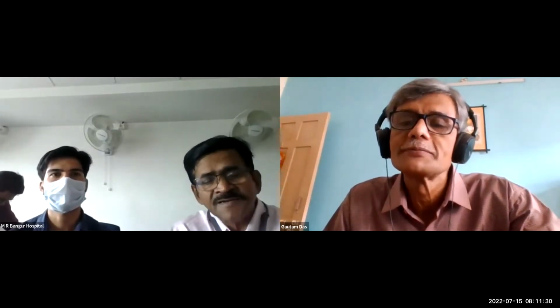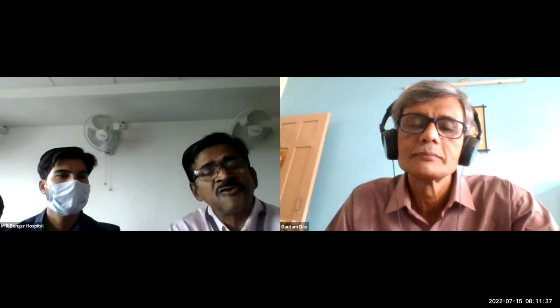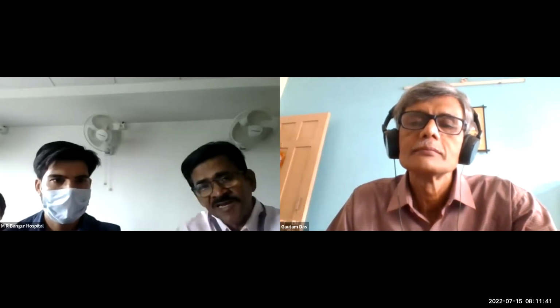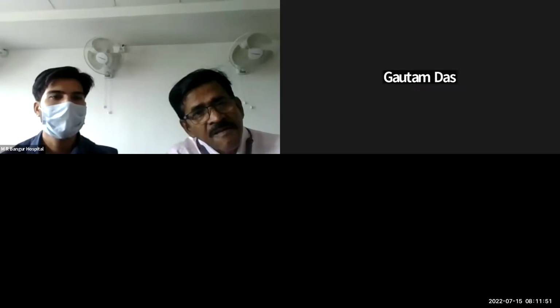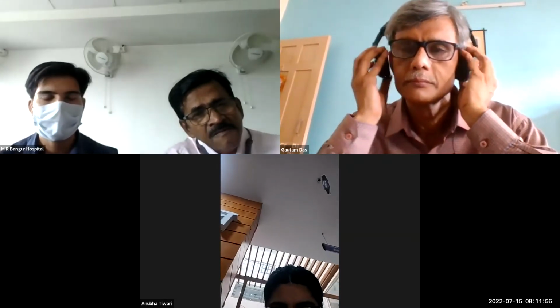Start the proceedings. Onkar, you have got a card of lap cholecystectomy. So the first question will obviously be, what are the indications of laparoscopic cholecystectomy? Tell us the indications of laparoscopic cholecystectomy. Sir, chronic cholecystitis, acute cholecystitis, porcelain gallbladder, acalculous cholecystitis, cholesterosis of the gallbladder.